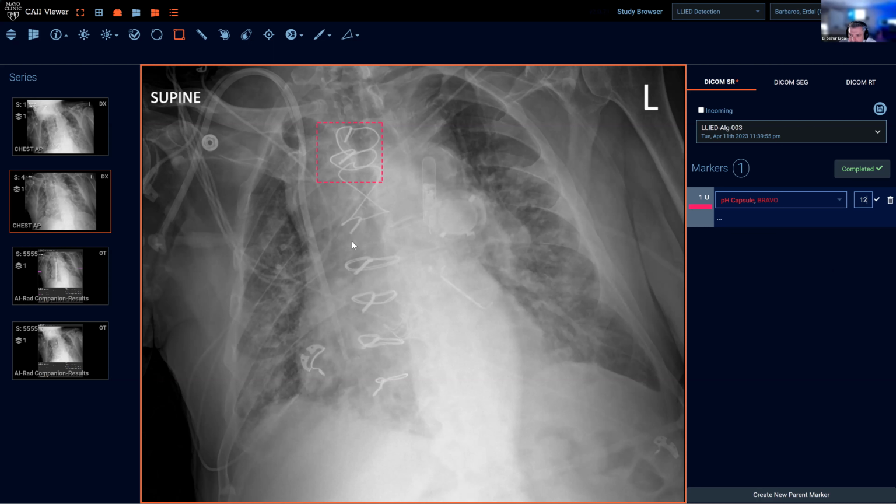Along the way we had to make customizations, but all these customizations are possible because of the open source nature of the OHIF platform. One of the first things we did was tie the backends for Orthanc with backends that will store the feedback for OHIF, meaning the data with users' feedback. And once you have these two together, then you can retrain your algorithm or display the content in real time in context with the clinical data. That's one of the customizations we took on. It was more of a configuration at some points, but that's one of the main things we did to deliver the content in real time.